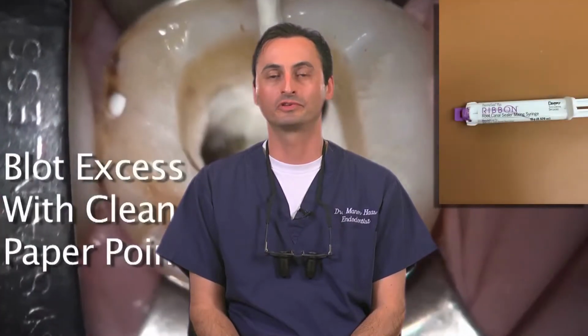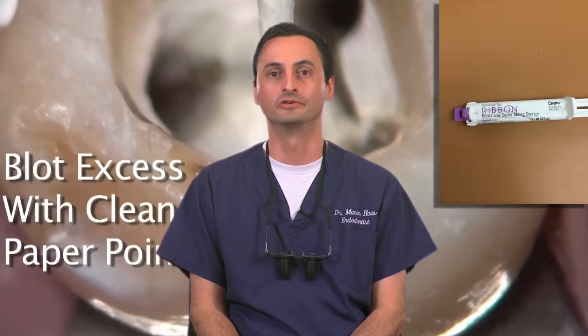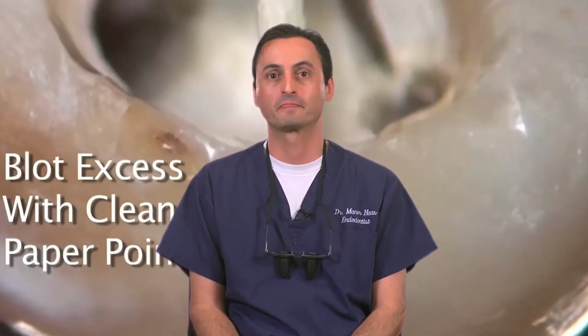As a note, I do not recommend you use a quick set sealer or a liquid powder based sealer. No matter how you mix that sealer, it's not likely to be an ideal GuttaCore lubricant and perform as well as a liquid to liquid based sealer. Tulsa, the pioneer of carrier-based obturators, designed GuttaCore with a liquid to liquid based sealer in mind, and in turn, that's what should be used and is what I use and recommend. It's what's meant to be.